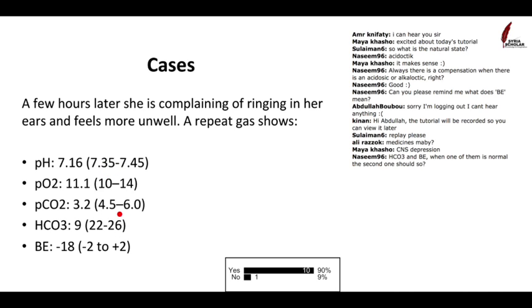That's very, very classic of a very particular drug that she might have overdosed on. So there's one thing in particular that tends to give you this exact picture, especially in somebody who's complaining of ringing in the ears. Does anyone know what that thing might be? I'll put on some options. Which one of these drugs do you think might give you the picture of what this girl has described?